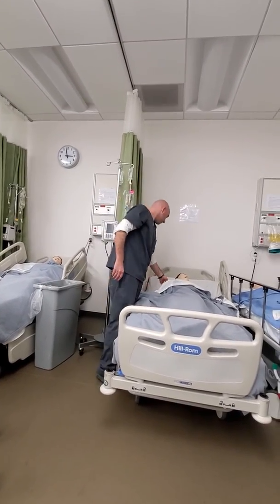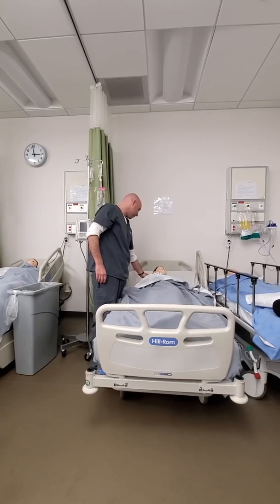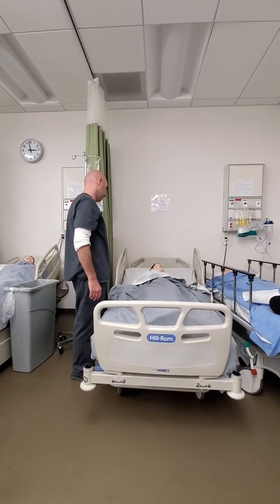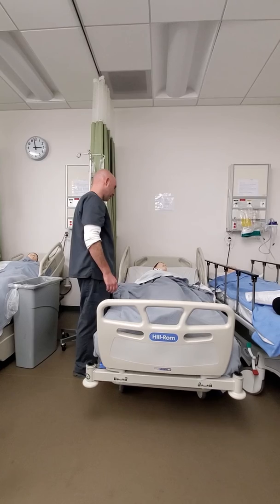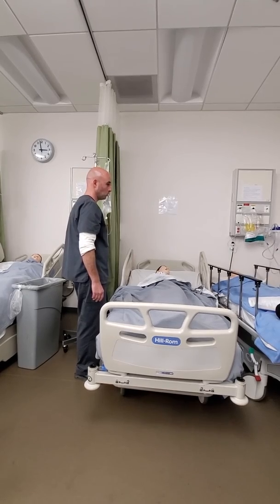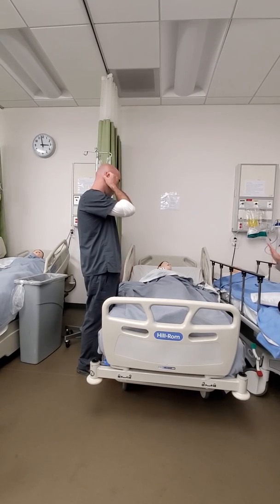I didn't do something I should have. Should have checked, should have palpated for any pain. Ask her if she's feeling any pain. Look for signs of redness, any swelling, any noticeable discharge through the patch. Always start at your patient and then work your way up. So assessing the IV always before you spike the med, because what if there was something wrong with it? Then you spike the med and you can't use it again. Always assess the patient first.